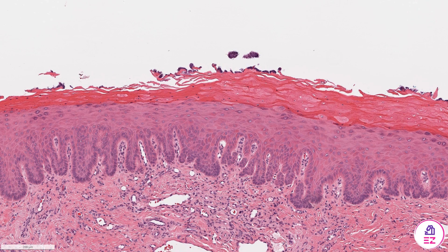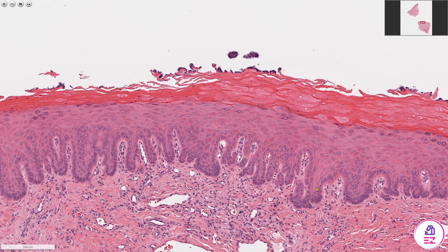Hello and welcome to Path Made Easy. Today's case is an example of moderate epithelial dysplasia. On screen we have some oral mucosa, and the epithelium is on the surface here with the lamina propria beneath that.